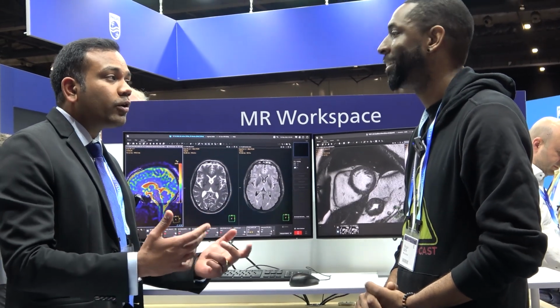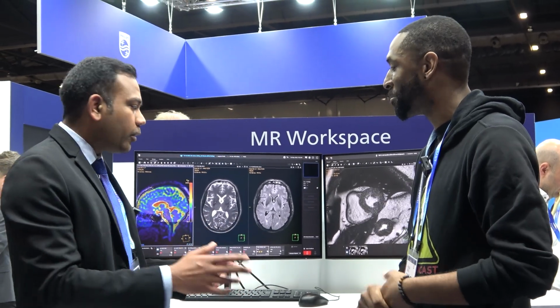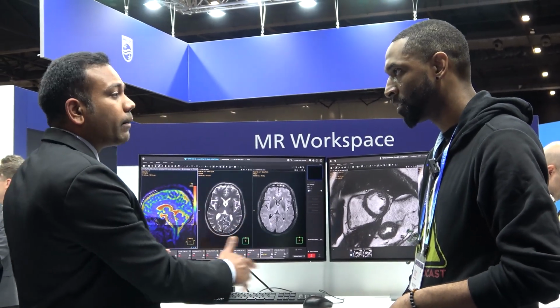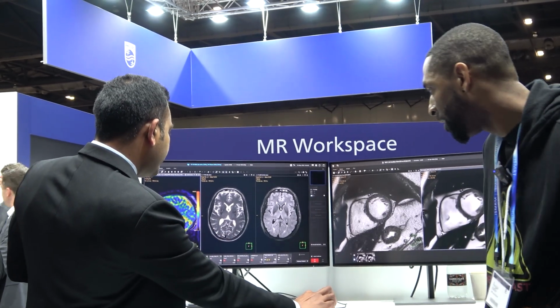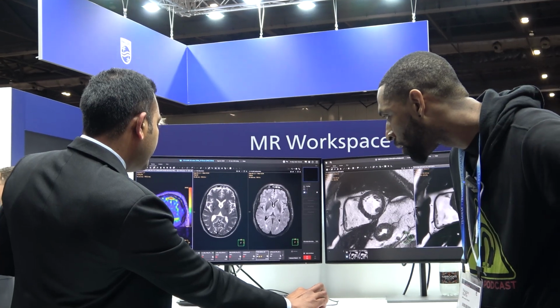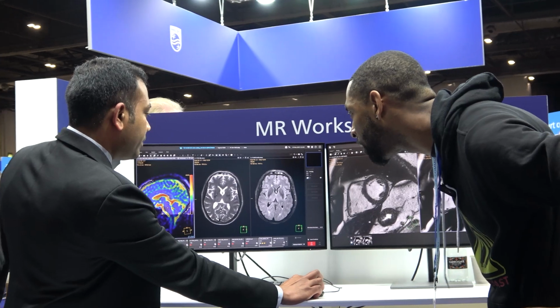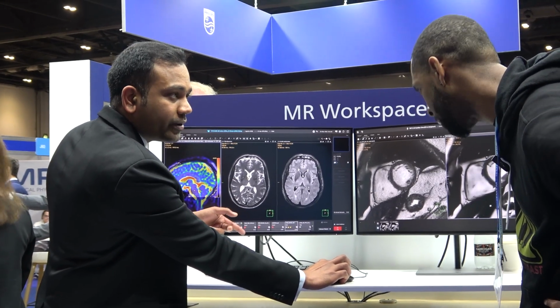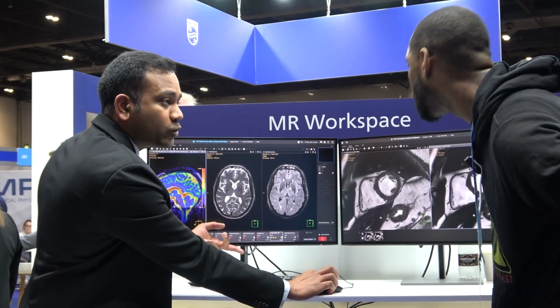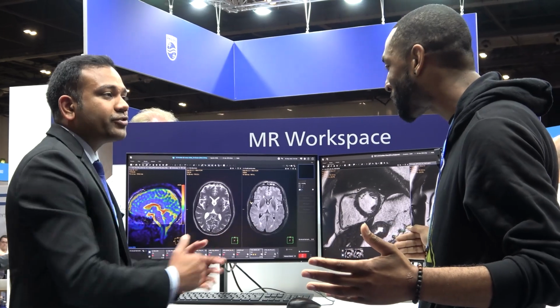Wow. So in the past it was always two different coils. Right, you have to disrupt the workflow. Now you put the patient in once and get the complete imaging in one go. What you're seeing here are images of sodium in the brain. You can look at the color images over here, and on the right side of the screen you have a normal T2 imaging, and a FLAIR imaging also. So one exam card, you push in the patient once and get one workflow.